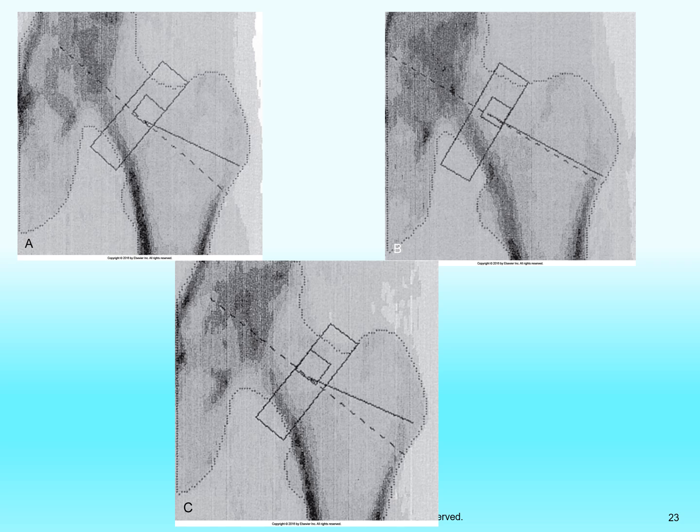Letter C and letter A are independent of each other. They will be precise measurements. They will be very close together. The measurements will be in agreement with very little variance. Letter B is subject to a lot of variance because of incorrect performance. The toe was allowed to roll out in letter B.